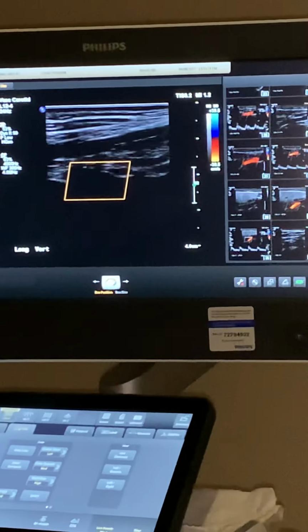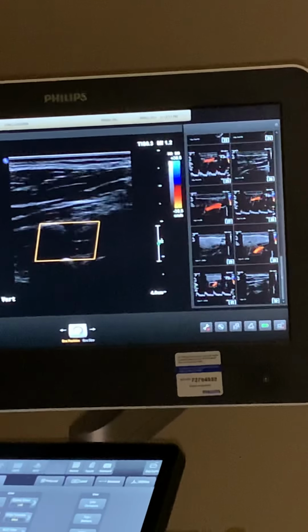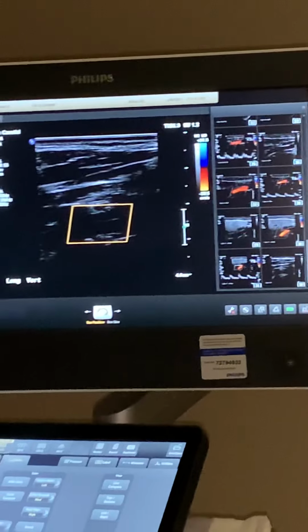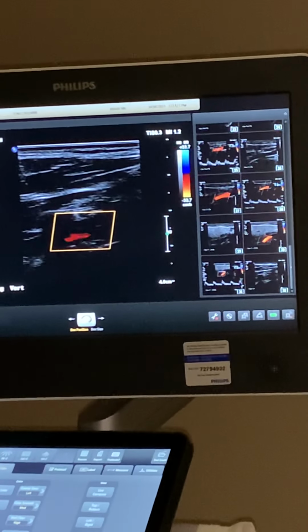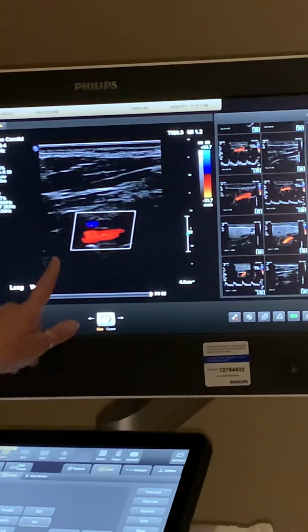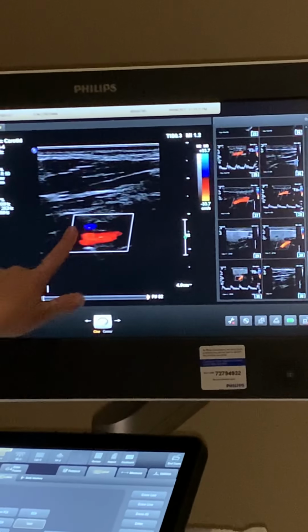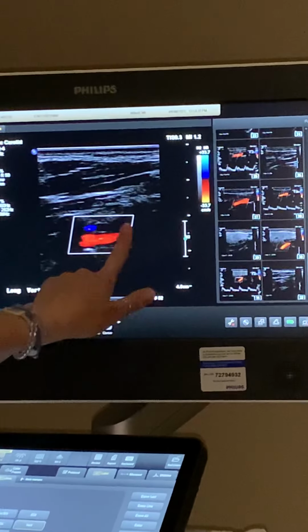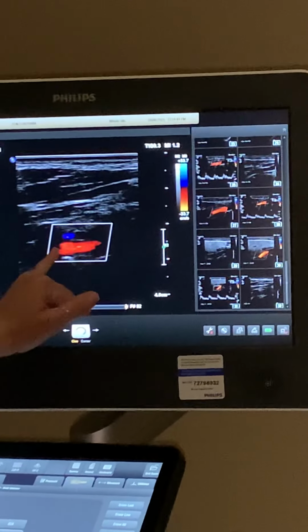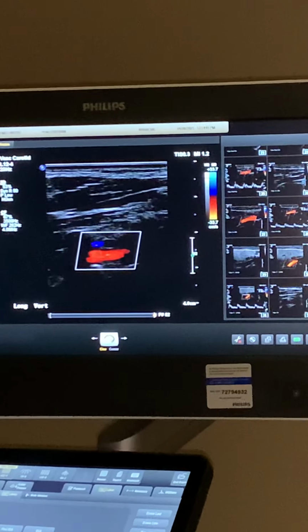Plus, just know that there are some of our clinical sites that make you do proximal, mid, distal on vertebral. So when in Rome, do as the Romans. Here you will only be obligated to do one. All right. Because we're always telling you want color to fill edge to edge on your box. Well, this shadow off of the vertebra is what's keeping that color from going edge to edge here. So this is fine, as long as the visible portion of the vessel that you have on your screen is filling with color, that will work.